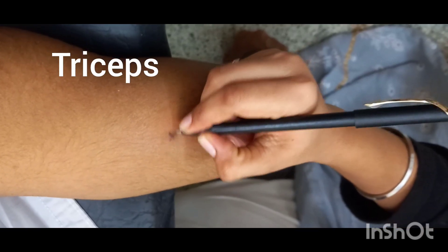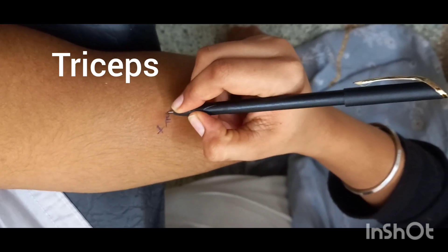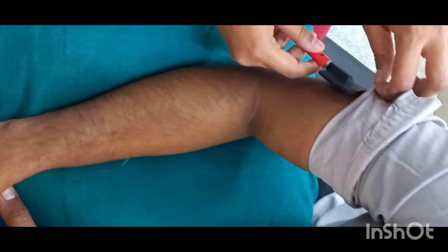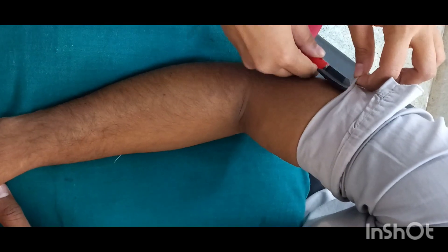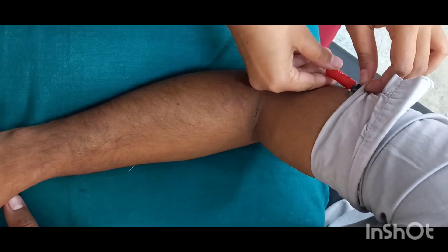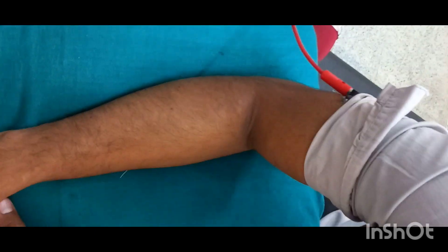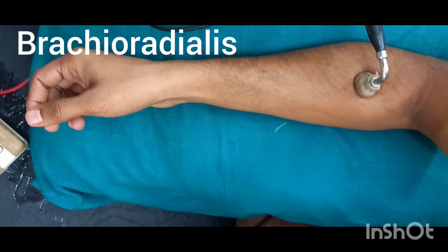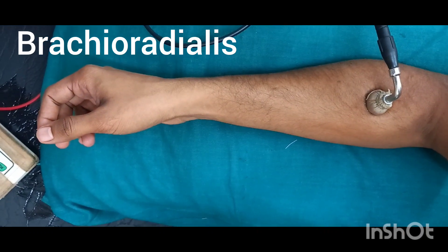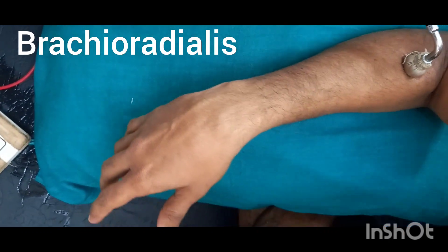Then triceps. For the next muscles of the radial nerve, anode placement over the bicipital groove. Brachioradialis. Muscle action: elbow flexion with hand in mid-prone position.